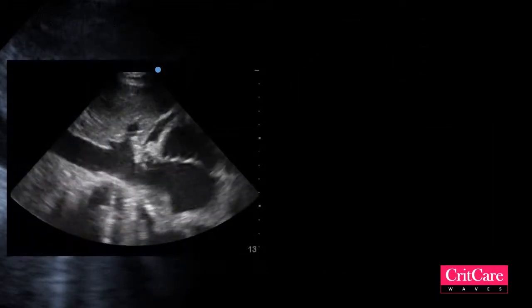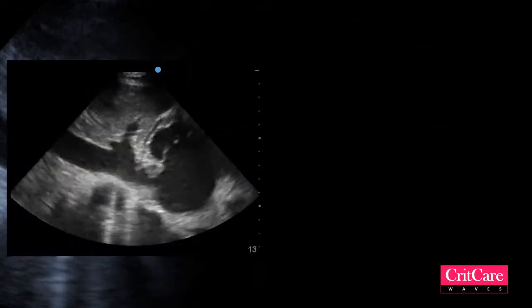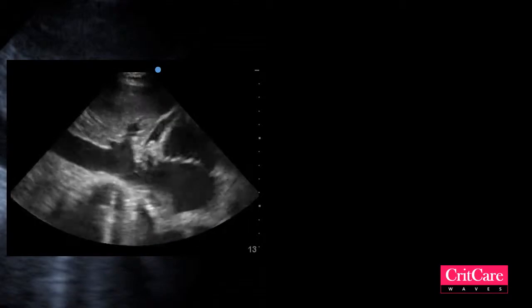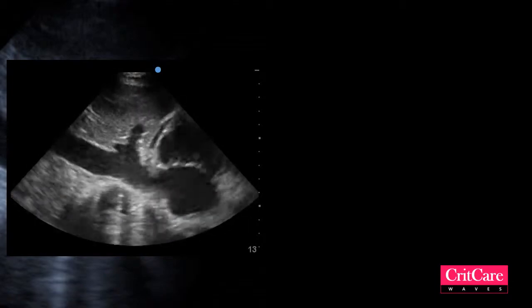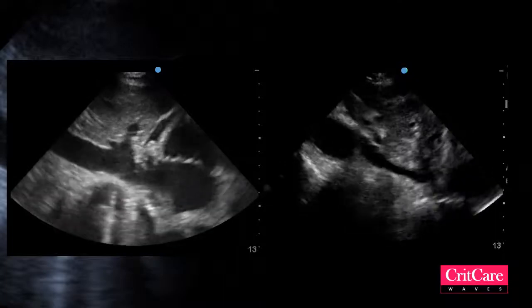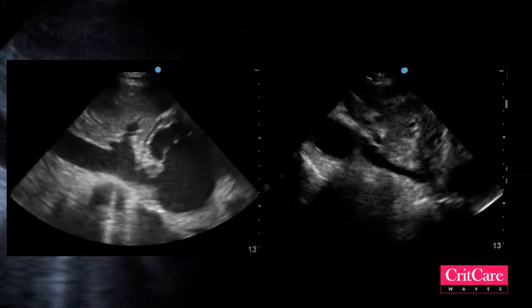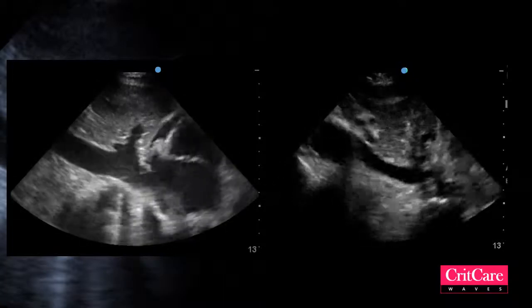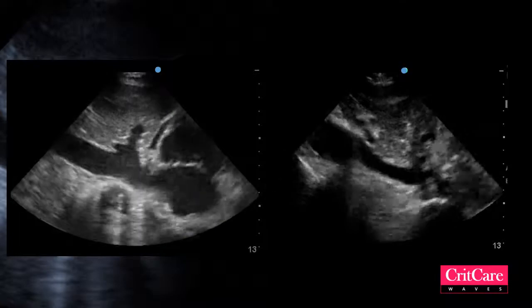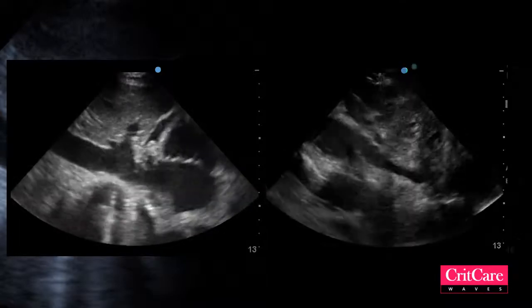On the left of the screen you can see a normal IVC that's slightly less than two centimeters and collapses almost 50%, as opposed to this IVC that is also less than two centimeters but almost completely collapses — in fact, obliterates its lumen — with respirations.